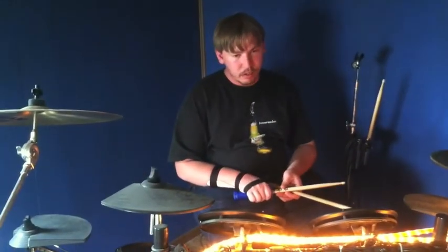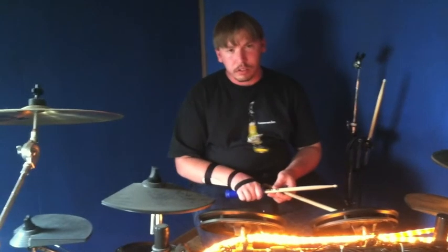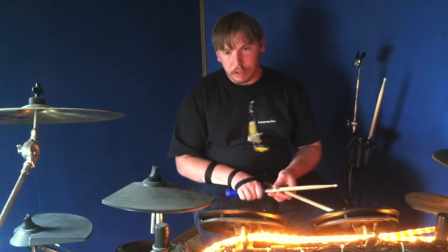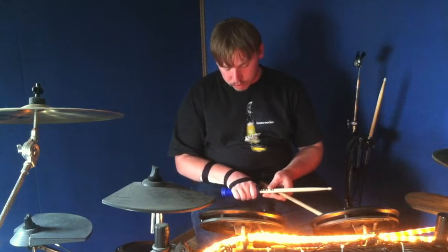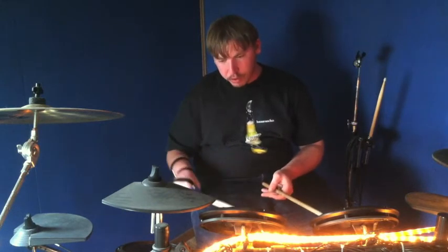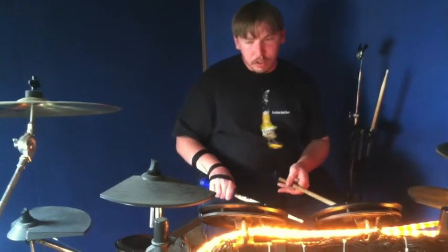So how did that feel anyways? Good. Did it? Okay. Does the fit feel okay on that? Yeah. And we could probably also make another one out of maybe different types of material, whether it's perforated or whatnot, so it can be a little bit more breathable. And did you feel like you're able to grip the drumstick pretty good, Nick? Yeah. Okay, cool. So definitely a cool little play leisure occupation for Nick to participate in there.